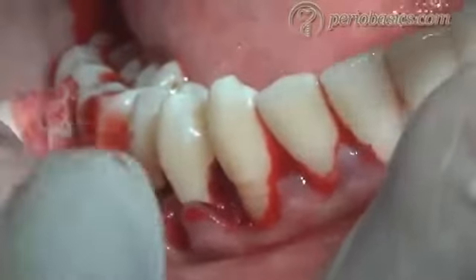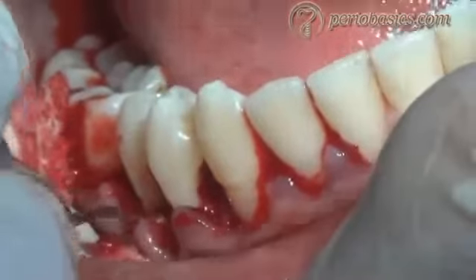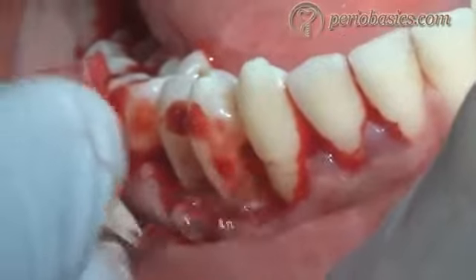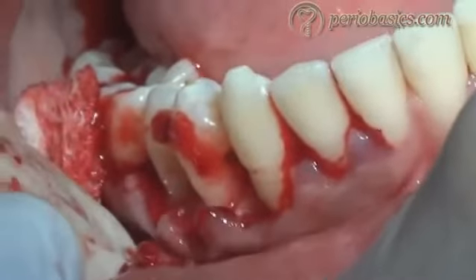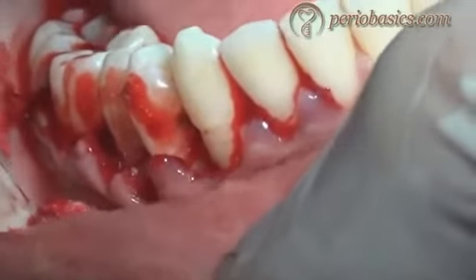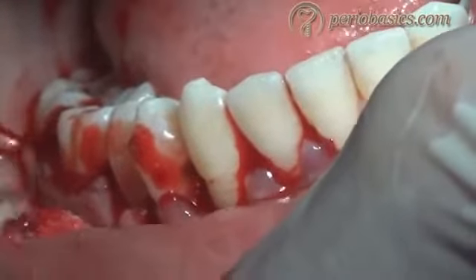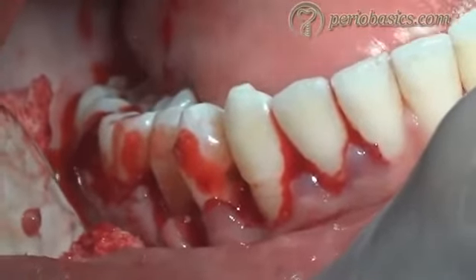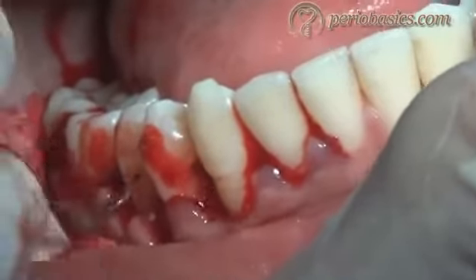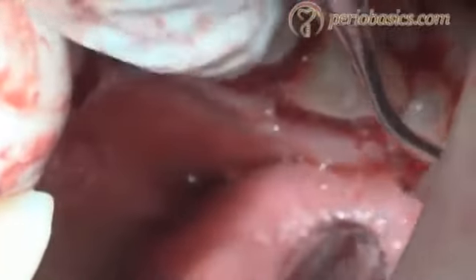And then we start with the removal of the granulation tissue with the help of curettes. So all the granulation tissue in between the teeth is removed, and as we have complete access to the root surfaces, the root planing is also done. And the same procedure is repeated on the lingual aspect.